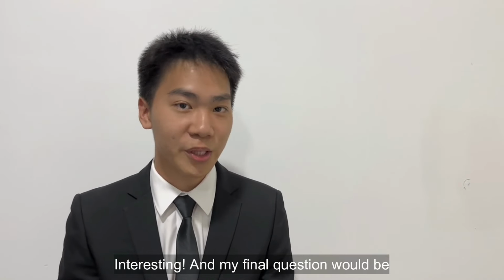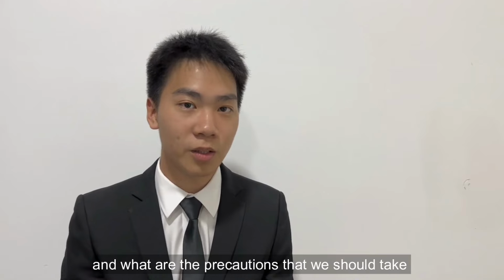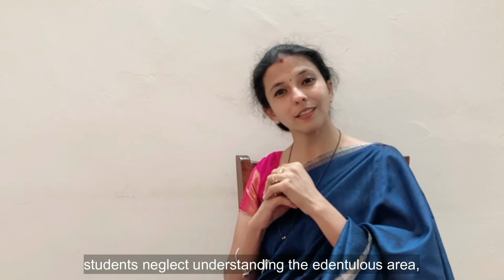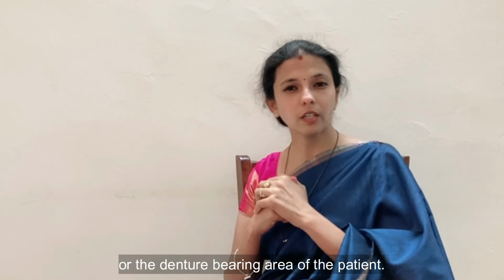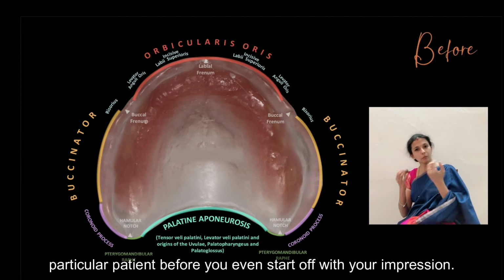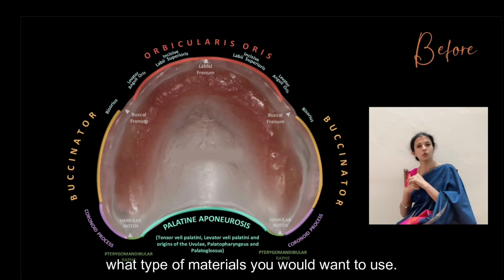Interesting. And my final question would be, as students, what are the common mistakes that we make, and what are the precautions that we should take before, during and after the secondary impression taking? Alright, what I feel is most commonly students neglect understanding the edentulous area or the denture bearing area of the patient. So it is important and mandatory for us to study the anatomical landmarks present in that particular patient before you even start off with your impression, because that determines what type of impression technique you would want to use or what type of materials you would want to use.